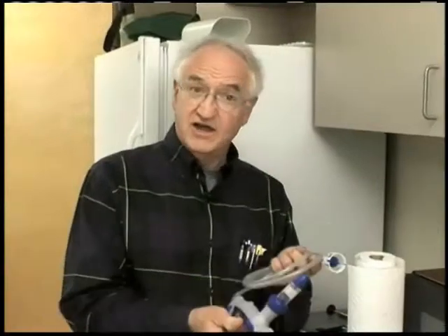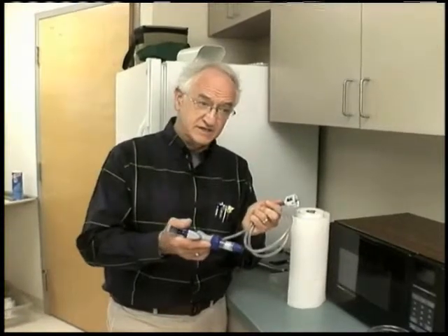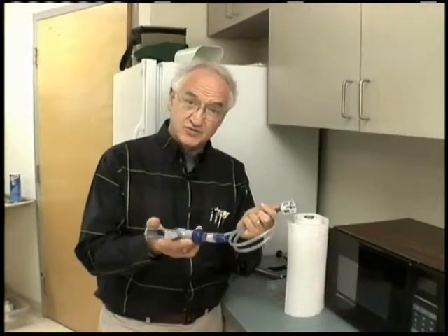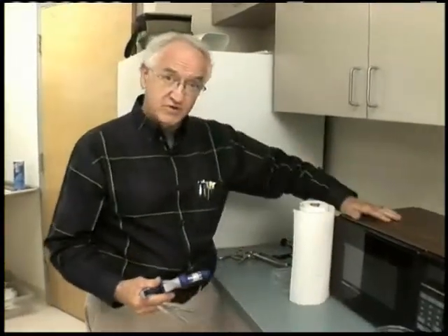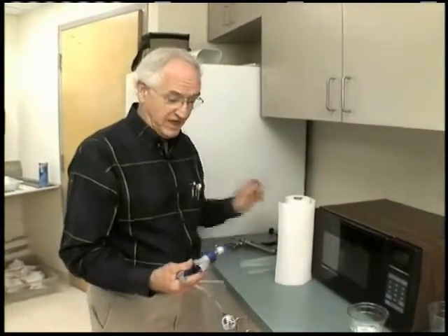We're going to talk about sterilizing syringes. This happens to be a 5cc vaccination syringe, but we could also use it for medication syringes. We'll assume I've started with a clean syringe. We never ever want to use any disinfectants or soaps in any of these syringes because of the potential residues that would have an adverse effect on the product. The other things I need are a microwave oven, some paper towels, and some sort of a ziplock plastic bag.